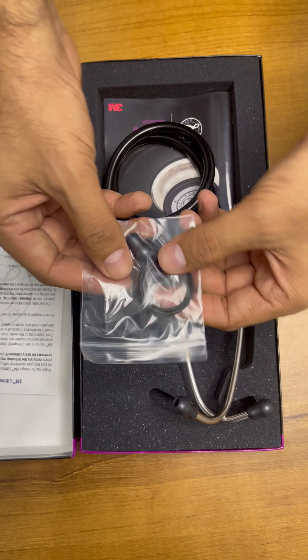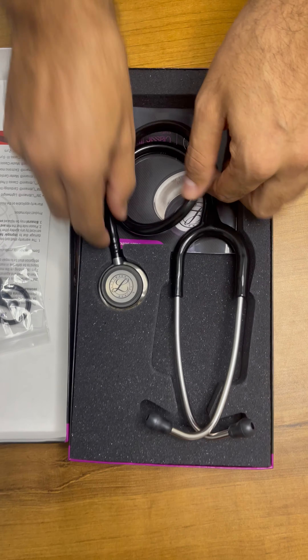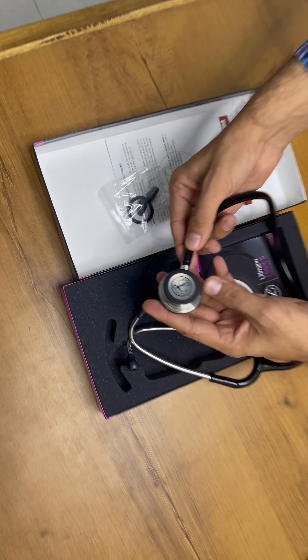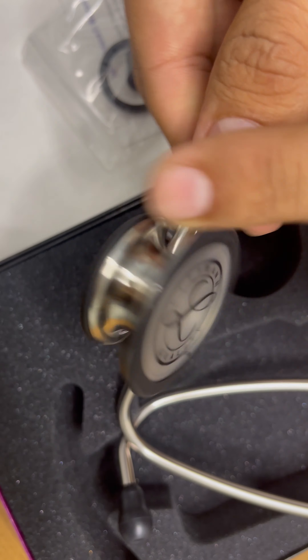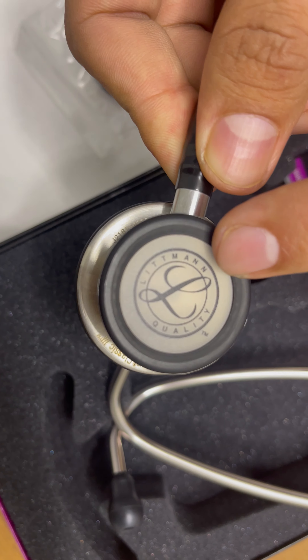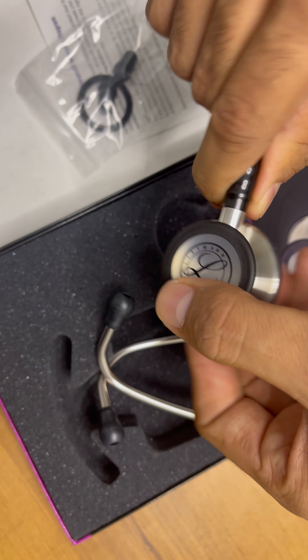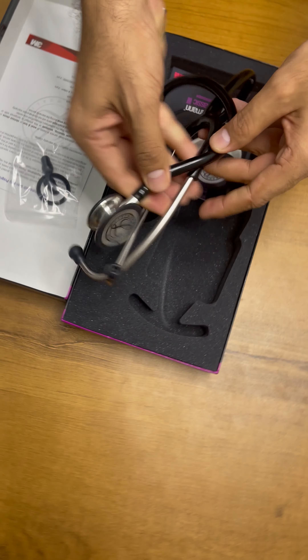The device comes with a spare part key, and you can see this is the stethoscope. Nowadays this stethoscope is used by pediatricians as well, because on the back side of the major diaphragm they have given a small diaphragm for pediatric use. You can rotate the sound from one side to the other. This is a good stethoscope, made in USA.